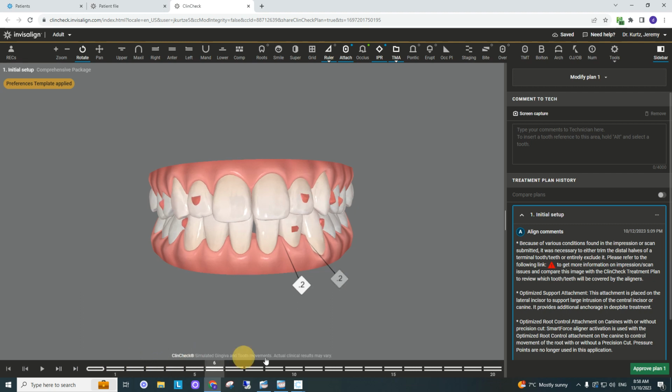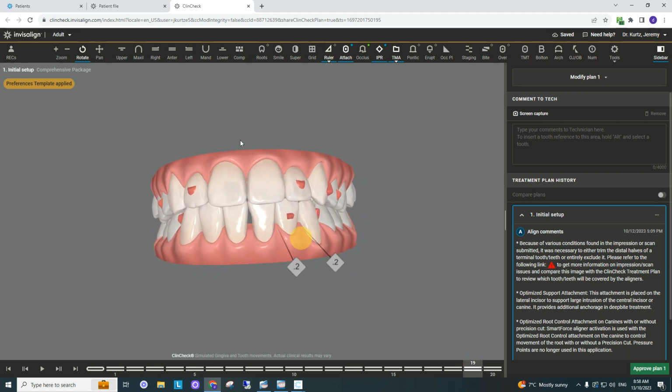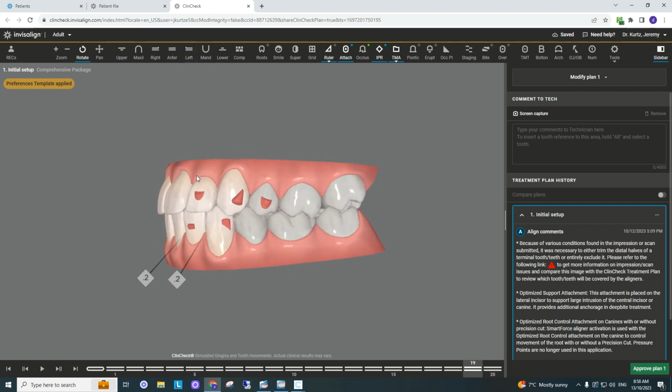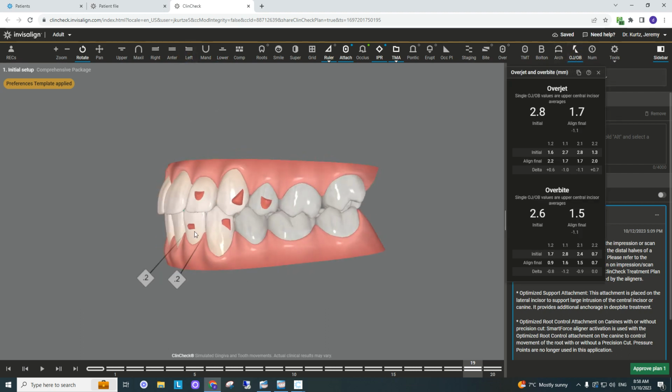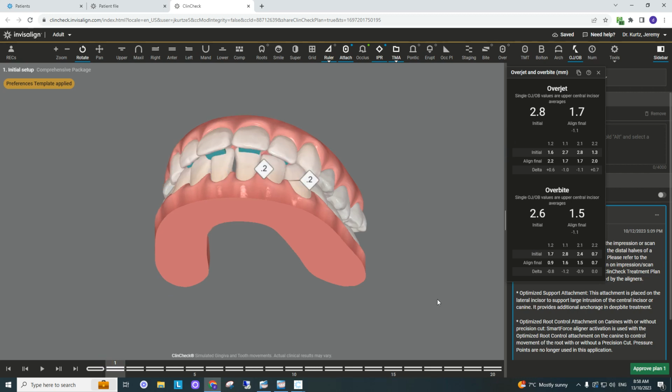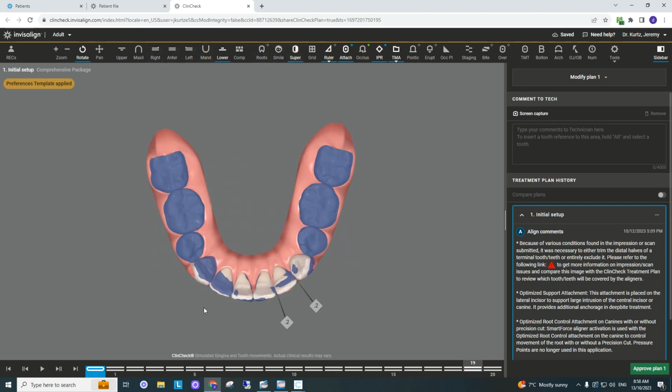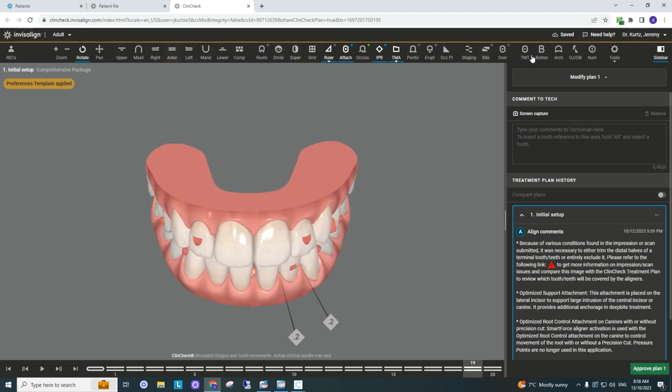So I'm looking at the video from all different angles to see what issues can be improved or simplified. So the first thing that's a glaring thing to me is that there's a black triangle between the center of the front teeth, and they didn't address it. If anything, by the shifting of the tooth, they've actually made it worse. So that's something that we're going to have to address. I can also look at the overbite and the overjet, where originally it was 2.8 millimeters, now it is 1.7. And then another thing that I typically do, which really is not as much of an issue over here, is check superimposition and see if there's any too much expanding or any other movements that are here.